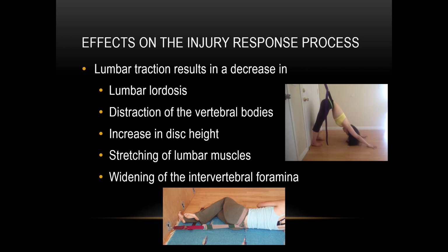Lumbar traction results in a decrease in lumbar lordosis, distraction of the vertebral bodies, increase in disc height, stretching of the lumbar muscles, and widening of the intervertebral foramina.